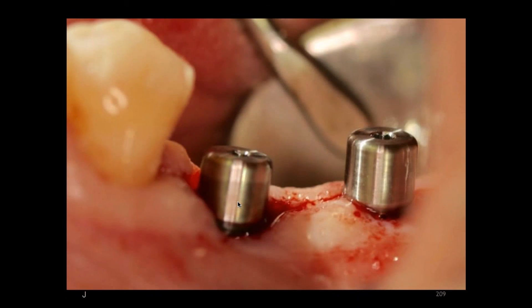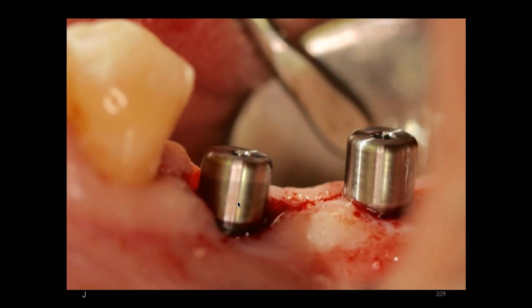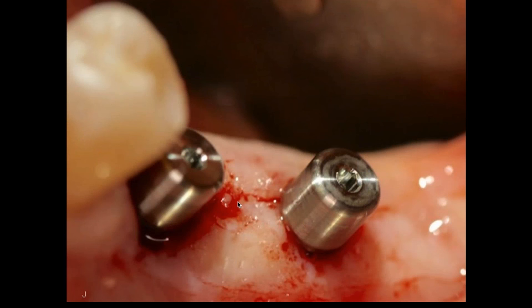These are the Han implants — you can see the configuration of the fins or threads in the x-ray, as well as the configuration of the top of the implant, the collar or neck. And then we have the finished crown.